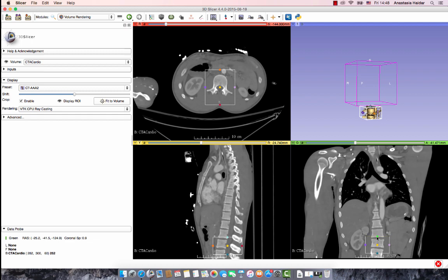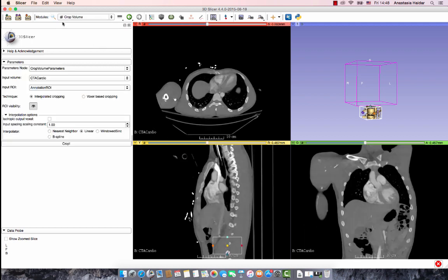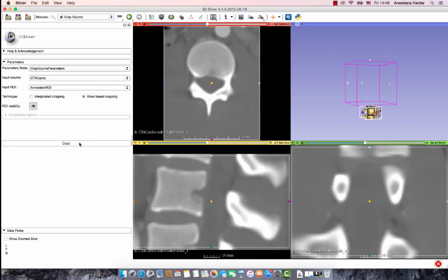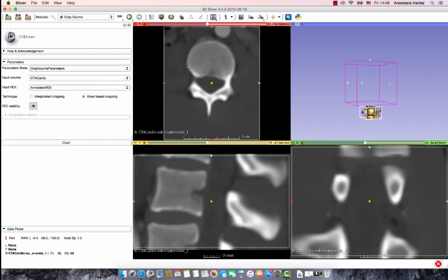Once you've made sure that the correct vertebrae is displayed inside the ROI, search for the Crop Volume module and select the voxel-based cropping to get a clear image. Once the image is cropped, fix the contrast and brightness as needed so that the vertebrae is more visible.